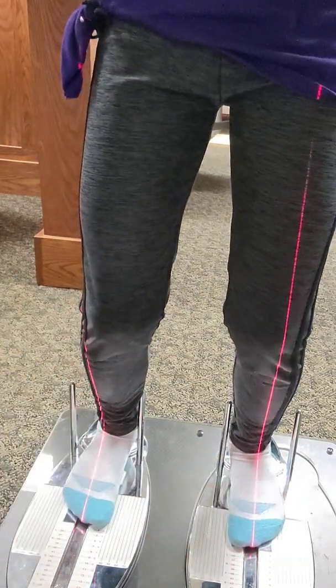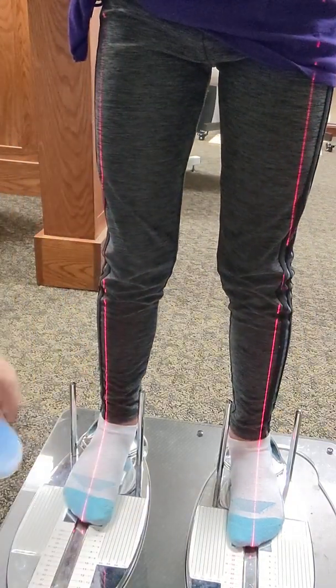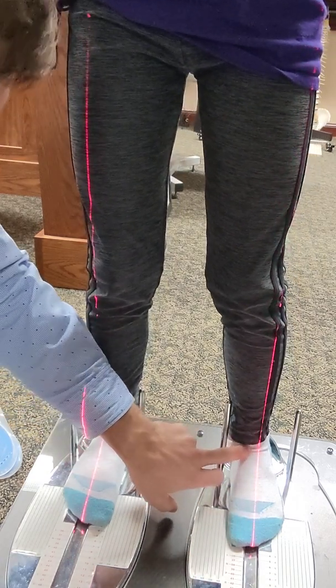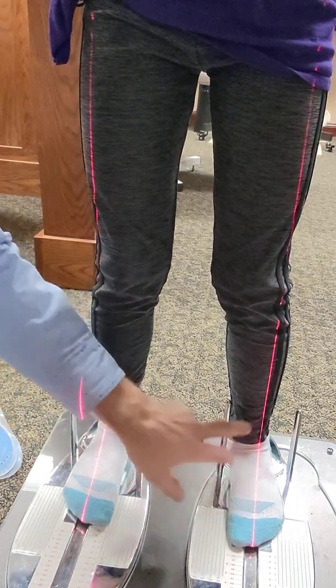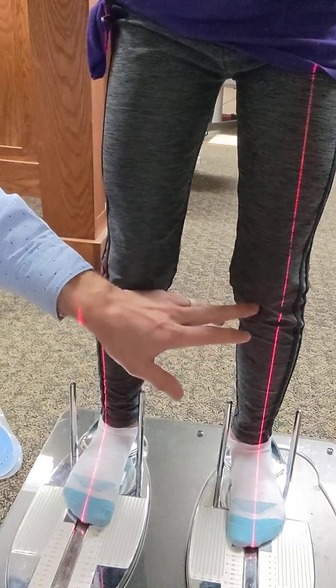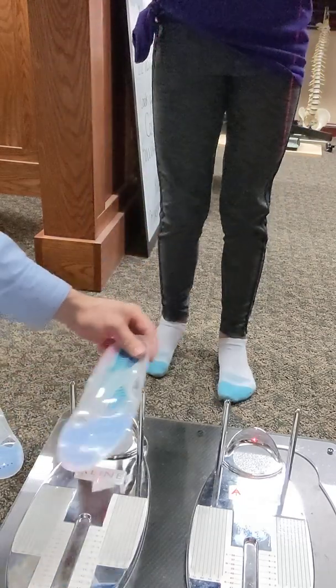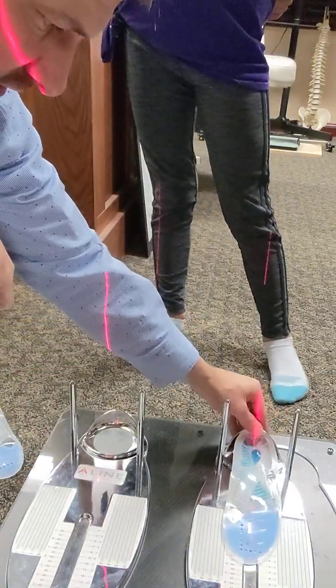So what we've done is we're going to put her in some orthotics. Our goal is to really get this to what we call talar neutral — that should be in the middle of her foot, and then it should start intersecting close to that knee. Go ahead and step off.